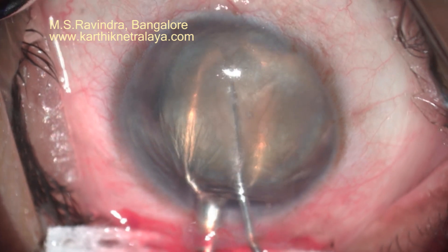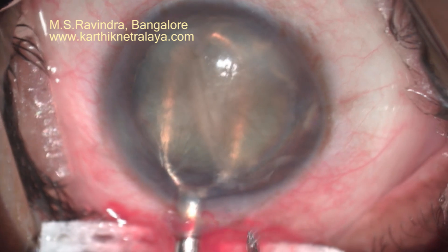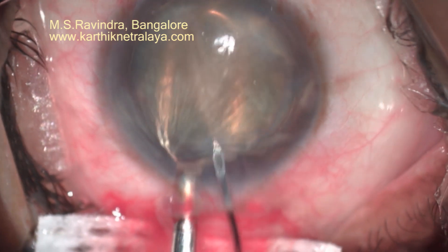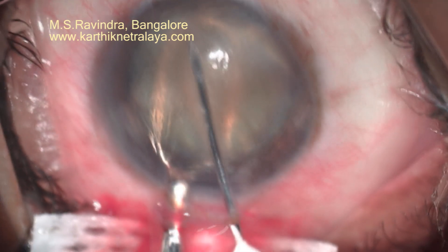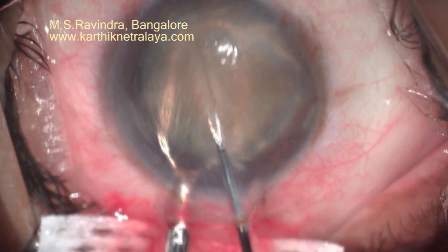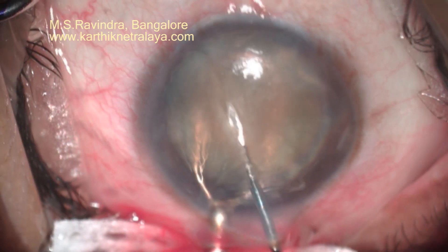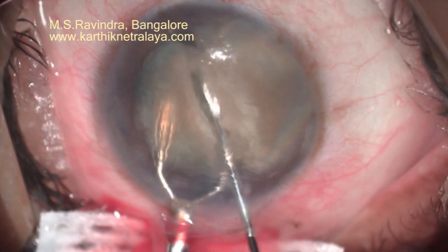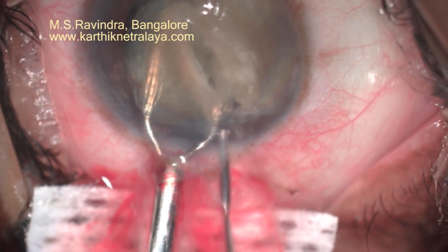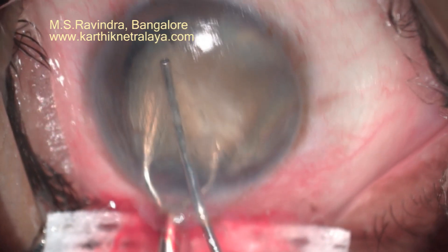The nucleus is supported by a mini wire vectis, which is quite small in size and remains within the anterior chamber throughout. The nucleus is quite hard and not bisecting with the 25-gauge cannula, so I use the help of the cystitome to score gently in the middle. The cystitome is mounted on a 2 ml syringe, and viscoelastic is being infused into the anterior chamber in front of the nucleus to minimize its contact with the endothelium.